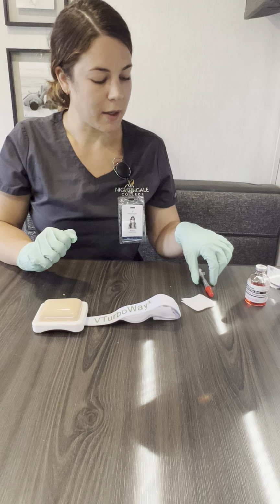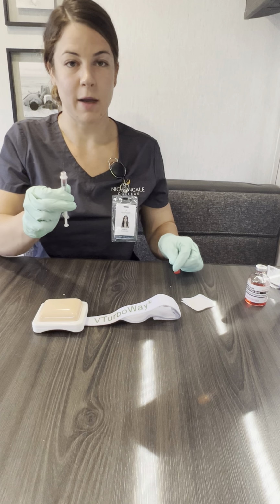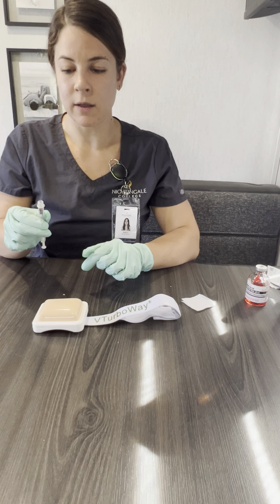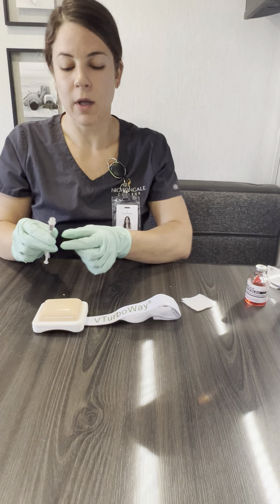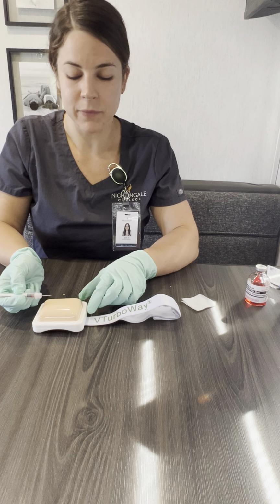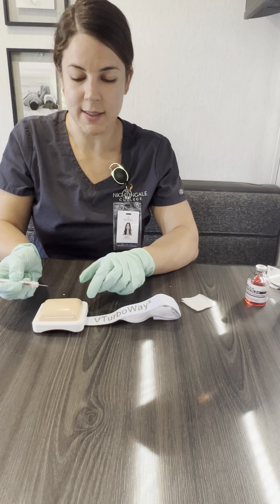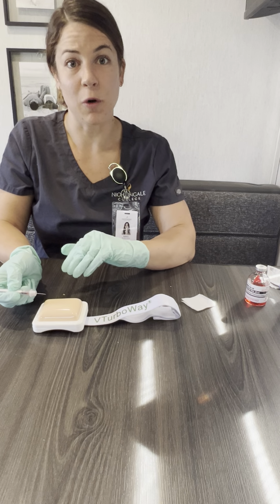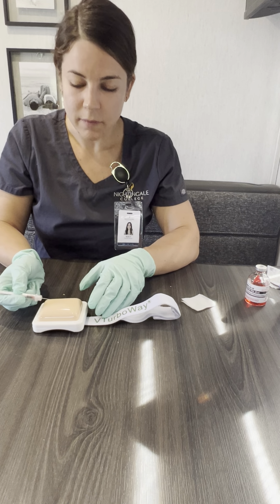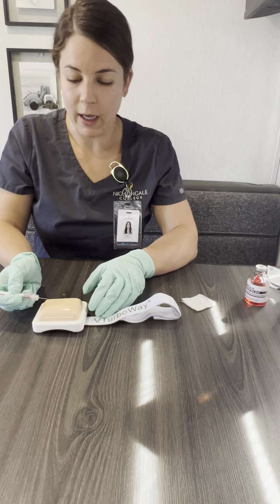After I've done that, I am then going to go ahead and carefully take the cap off of my prepared tuberculin. When injecting a TB test in the arm, you want to administer it at a 5 to 15 degree angle. You want to make sure that the beveled edge is facing up so that the bleb forms on the skin. You want to be about 3 millimeters under the skin. So at a 5 to 15 degree angle, I'm going to go ahead and administer.